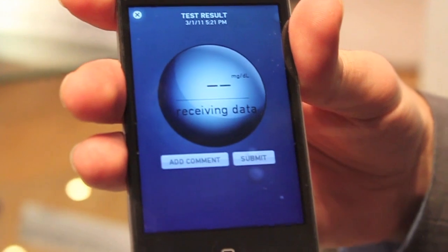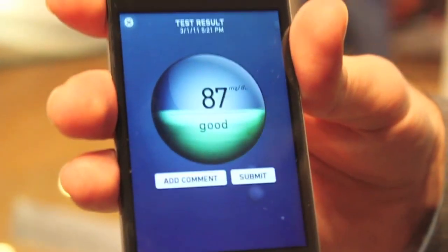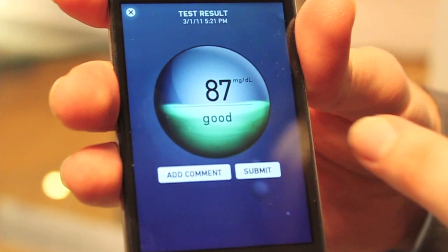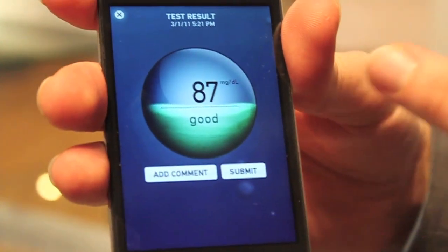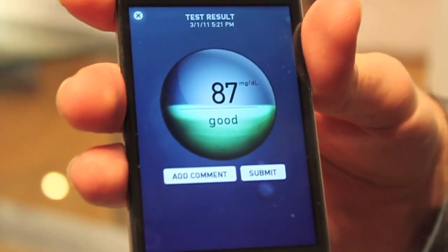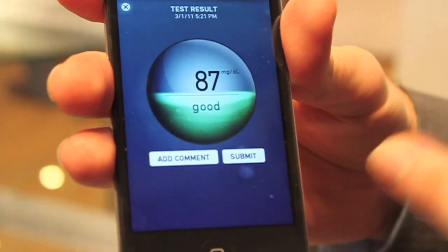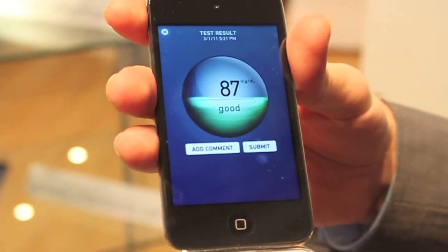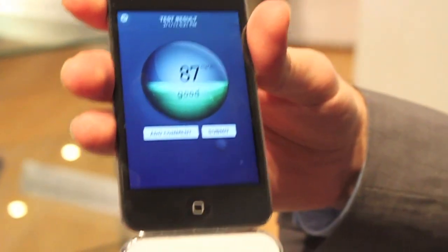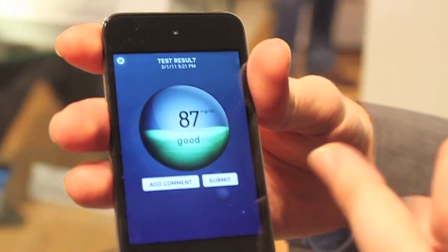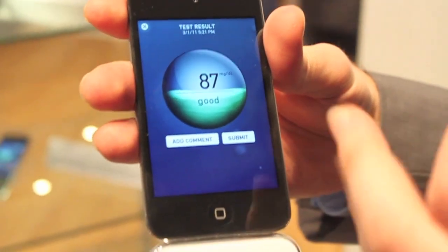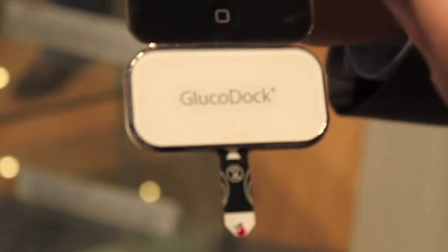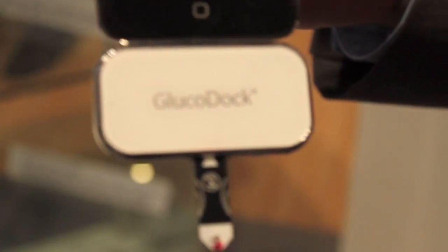After a few seconds we see the result: 87. There is an evaluation according to the user's target value settings. The user enters a range from 80 to 120, for example, and then everything within that range is regarded as good.